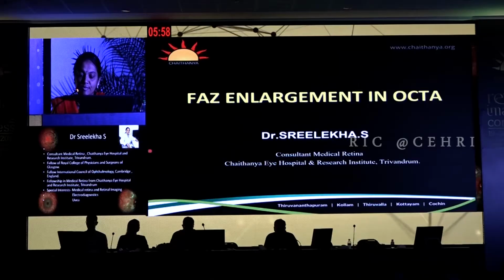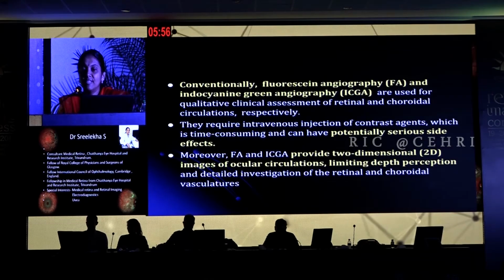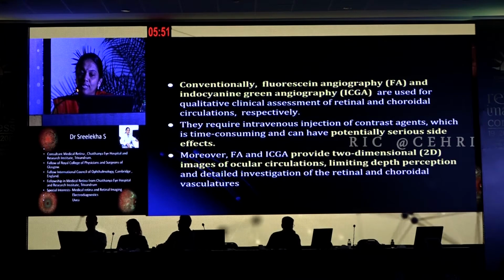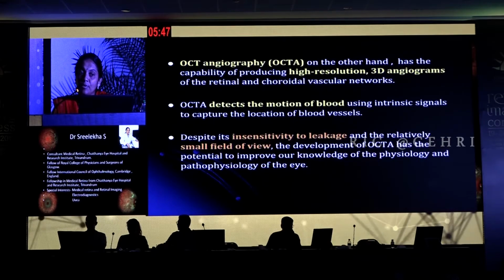Morning. I'll be discussing FAZ enlargement in various situations. Conventional angiography has its own potential side effects, and it only provides two-dimensional imaging of ocular circulations, limiting depth perception. OCTA has high-resolution 3D angiograms.